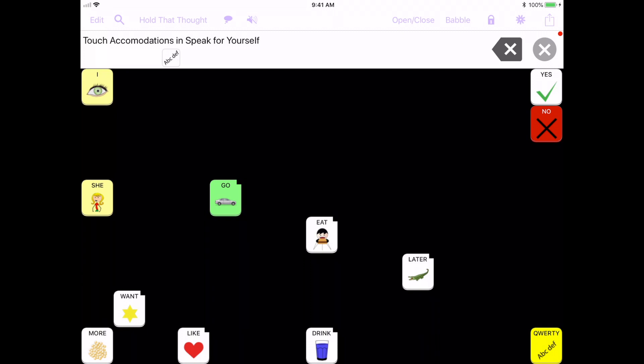There are some accommodations that are actually built in to the iPad. So while I'm talking about touch accommodations in Speak for Yourself, if you're using a different app or even if it's an app like YouTube or something else in the iPad, if this kind of accessibility feature is helpful to your child or student that you're working with, then this is something that you can use for any iPad related app or function.